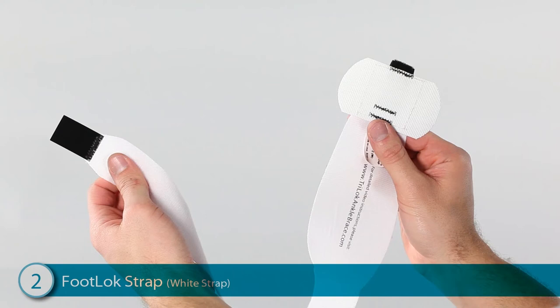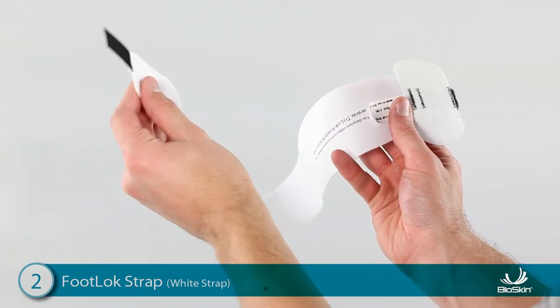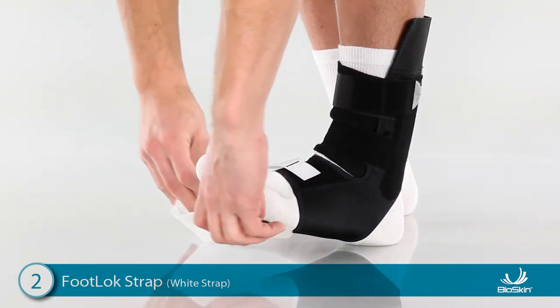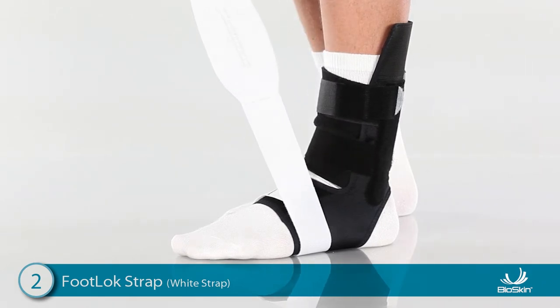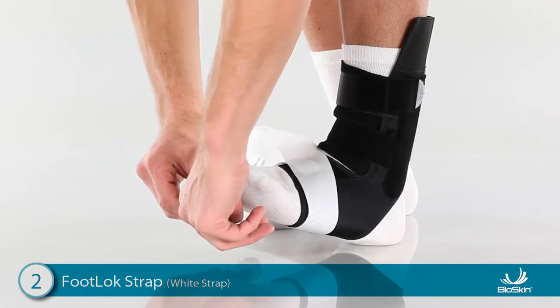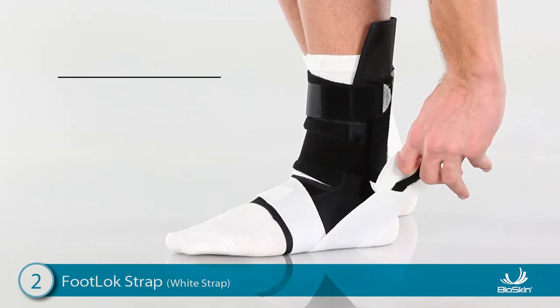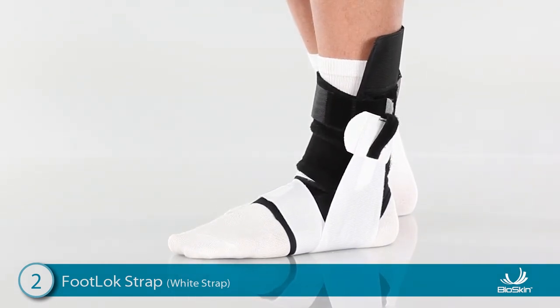Step 2: applying the white footlock strap. Hold the strap in front of you and locate the small Velcro tab at the end. This tab is black on one side and white on the other. Place the tab on the top of the foot with the black side down and the strap laying toward the inside of the foot. Wrap the footlock strap underneath the foot and push the foot firmly onto the floor. This allows the foot to expand when body weight is applied. Continue wrapping around and press the strap onto the white side of the Velcro tab on the top of the foot. To complete this step, wrap the footlock strap underneath the foot again. Position the foot at a 90-degree angle and pull the strap up with a finger loop and attach high on the outside of the ankle. For increased support, lift the toes up and lift the outside of the foot as you attach the footlock strap. The footlock strap is now mimicking the ligaments and tendons supporting the ankle.